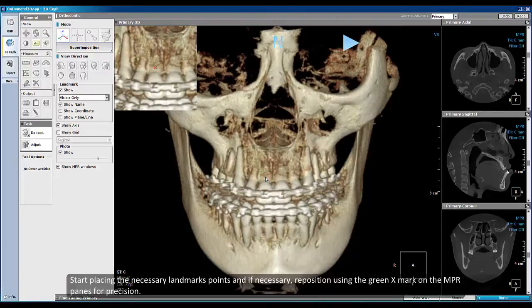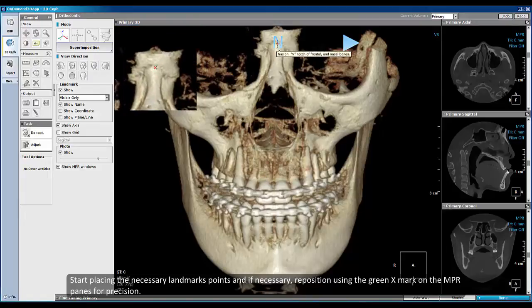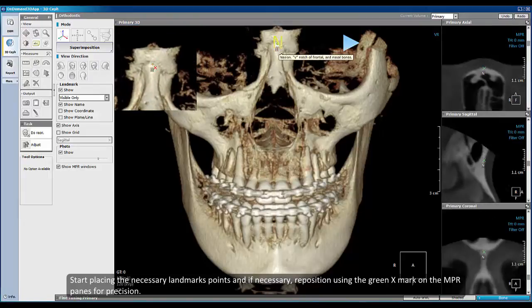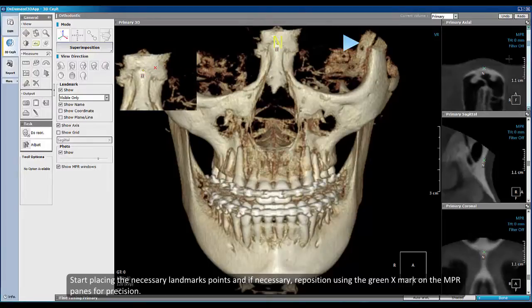Start placing the necessary landmark points. If necessary, reposition using the green X mark on the MPR pins for precision.